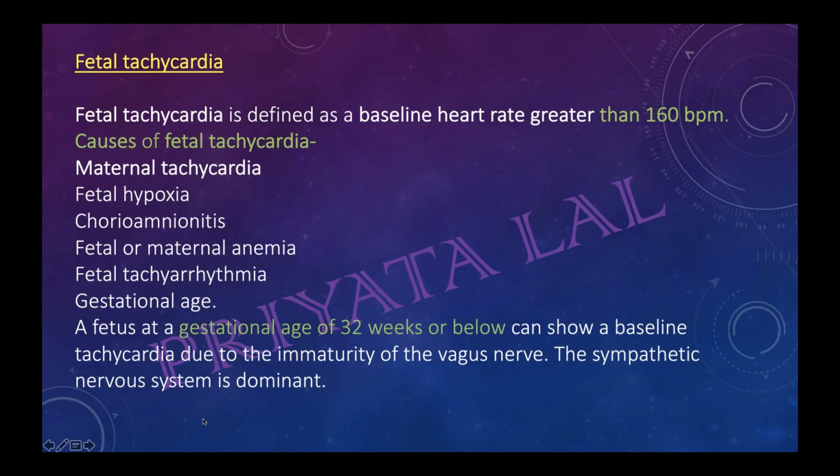Now this I just put, but it is not necessary for your exam because they never ask it. Only one thing you have to remember from here, that fetal tachycardia is more than 160, this we already know. So these are the causes. If you find that baby tachycardia is there, then you have to find out what could be the reason.